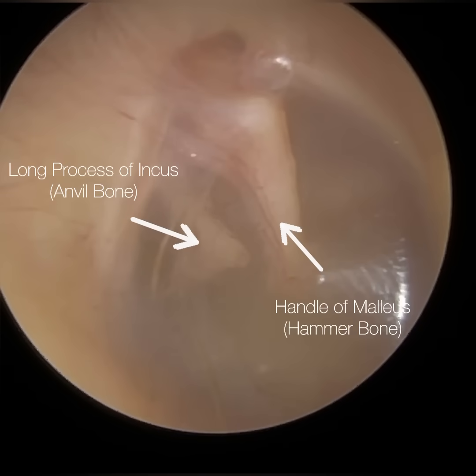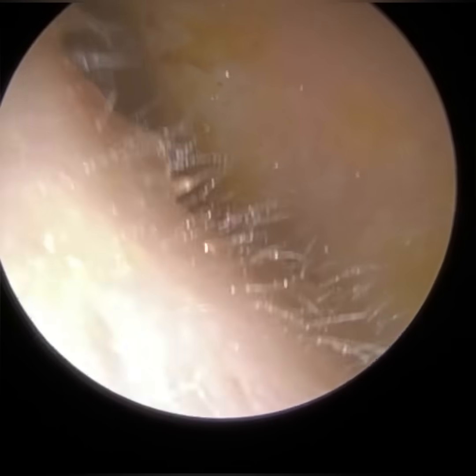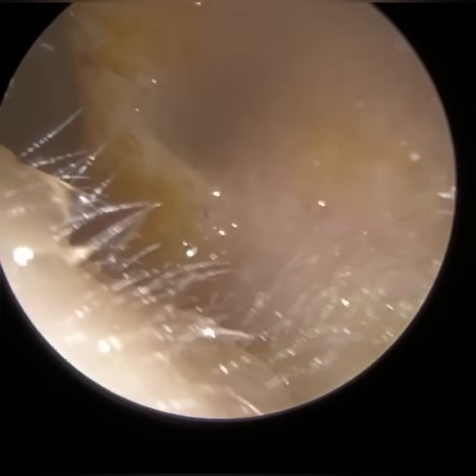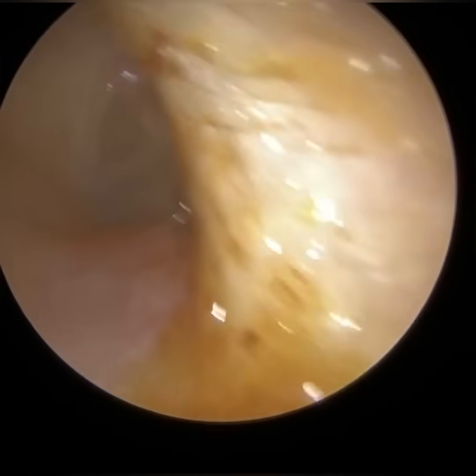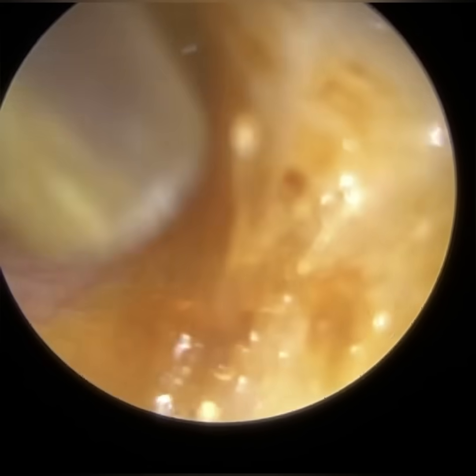There's less vascularity here. With the left side, the wax is more impacted on the eardrum — that's one of the reasons. I did perform a pressure test and both middle ears are functioning fine. There's no retraction, but on that side it would appear they had a bit of an attic retraction — the top part of the eardrum was slightly sucked in — but it was fine when I did the pressure test.